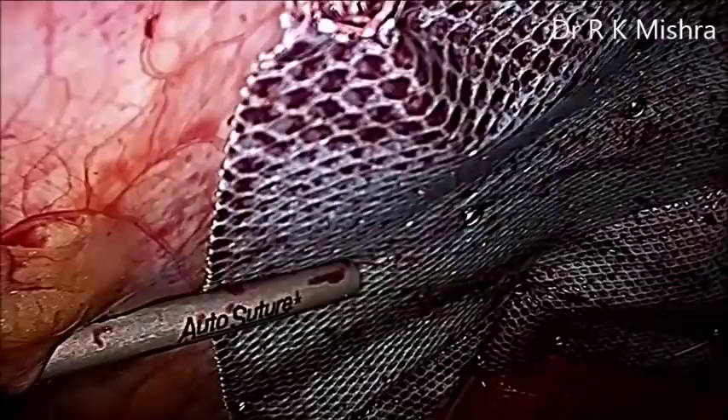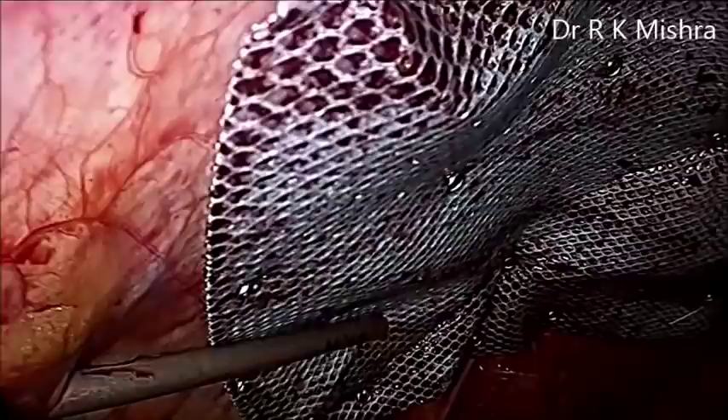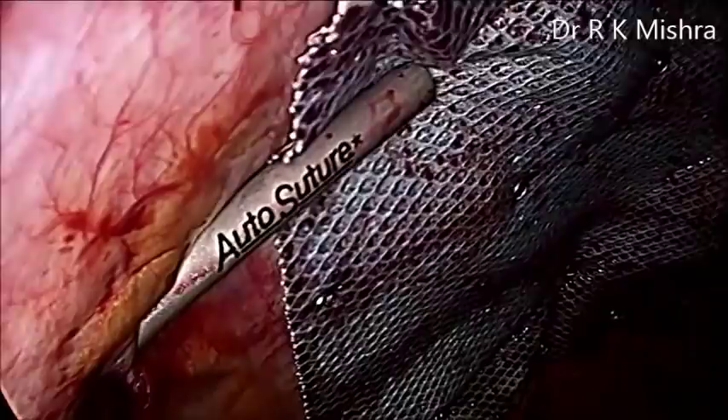Now it is almost fired all around. You can check it again and fire a couple more if required. Thank you very much for watching this video. This was a simple case of laparoscopic repair of umbilical hernia.